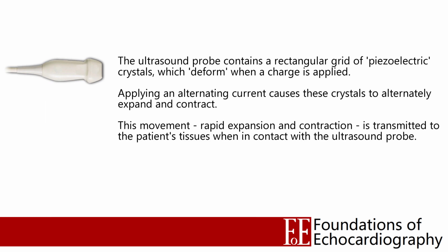And within the housing of this probe we've got a grid of piezoelectric crystals just below the footprint. Now the key feature of these piezoelectric crystals is that if you apply a charge to them, they will change shape, they will deform in a predictable fashion. So we can apply an alternating current, we can make the crystal get bigger and smaller, we can make it oscillate, and if the probe is held against our patient, then when we generate that kinetic energy, that energy will propagate through the patient in the form of a wave. Let's get a sense of how that's going to work in practice.